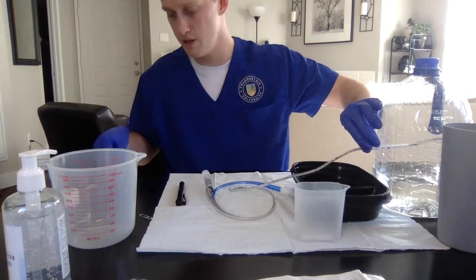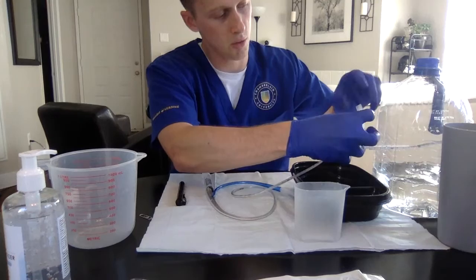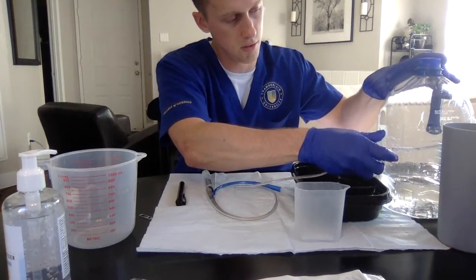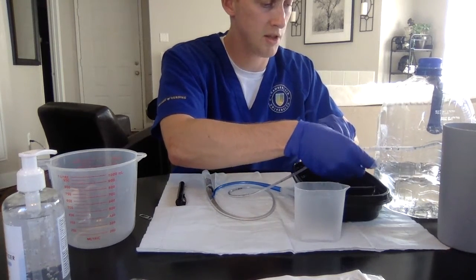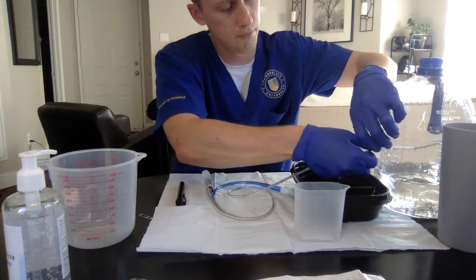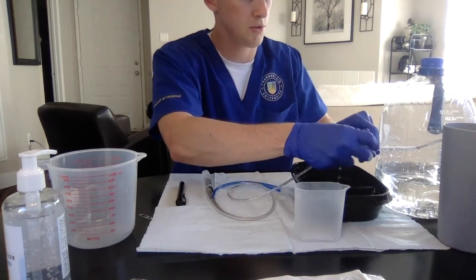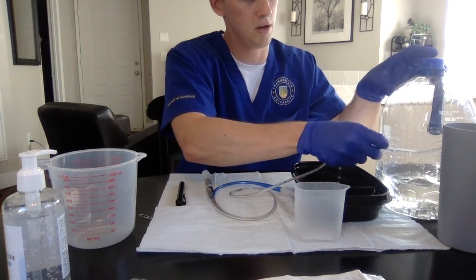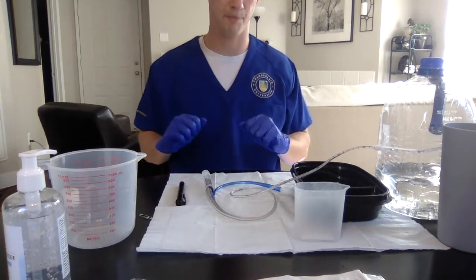So we're going to use our tape that we split like a pair of pants. We're going to make sure that we're holding this tubing the whole time until it is completely secured. So we're going to wrap these around. So this one's going to go underneath here, just like that. And this one's going to go underneath like that. So now that it is secured to our patient's nose, we're going to be able to let go of that.